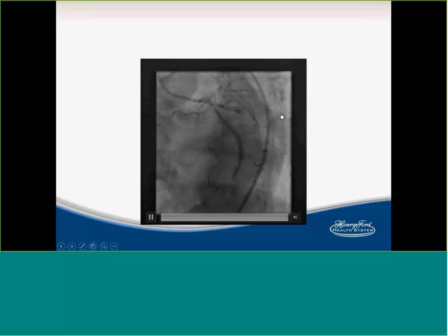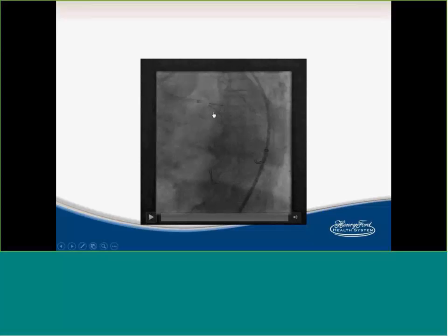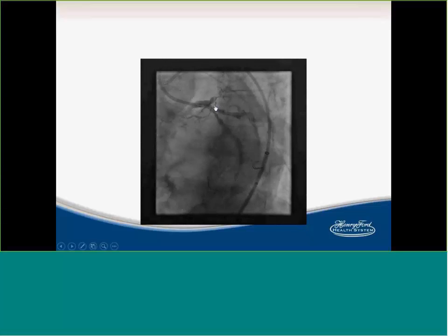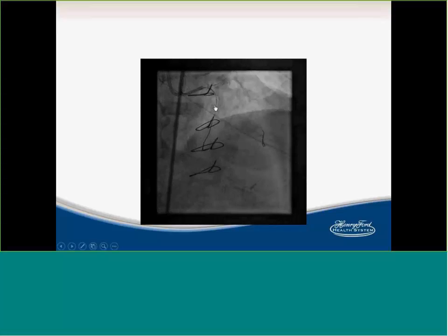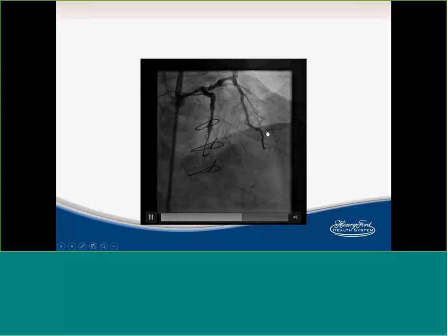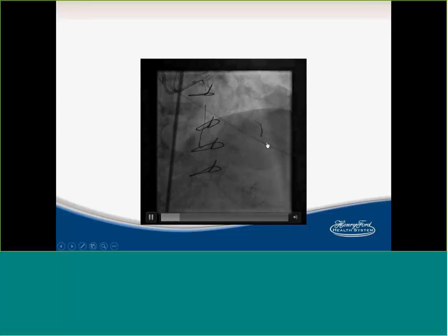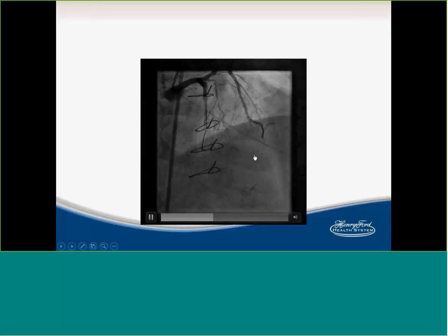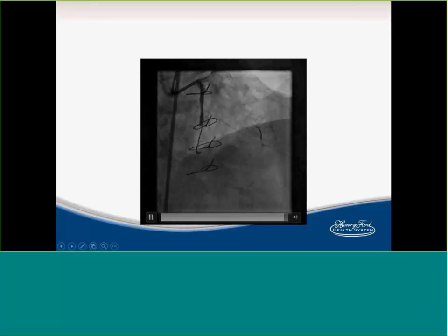At this stage, I wanted to make sure that the circ, this is the true lumen in the circ, is here. We simply did a V-stenting just to preserve access to both of them. And we got these results. So this is the circ. This is the branch still feeding via collaterals from this OM, and this is where we performed the reverse CART, and this is the RCA.